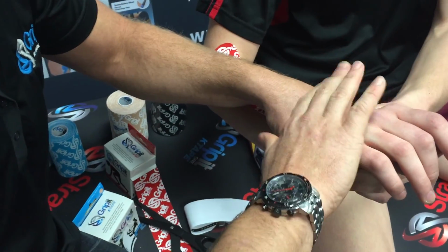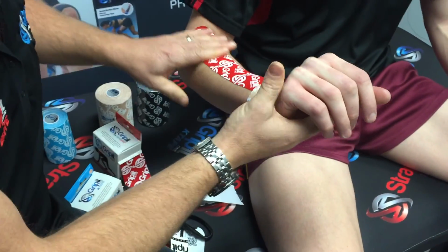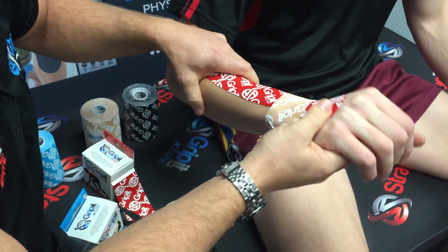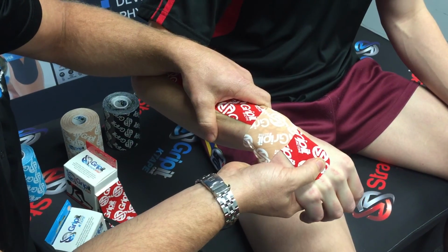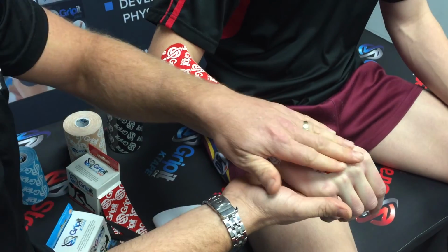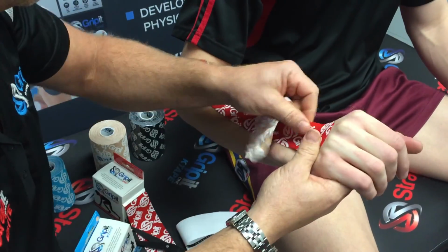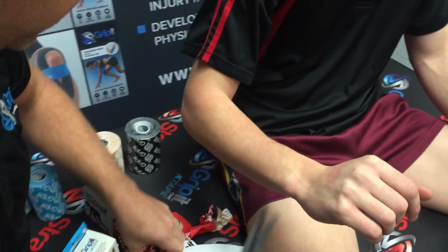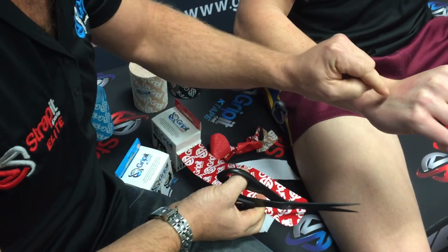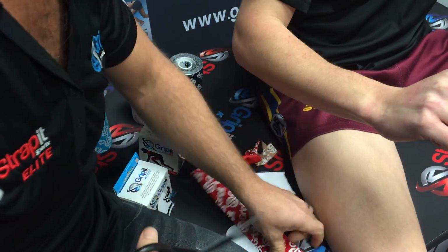If Daniel just lets go there, you can see that this tape is already under tension, and as Daniel drops his wrist, he'll feel that tape really wind up and stop that motion occurring, which means these tendons get a break. So that's one way we can do that, but I just want to show you another way today that's really cool, that really works on someone who might keep this tape on for an extended period of time, which means that this anchor point might need to be a little bit stronger. So let's show you that quickly.